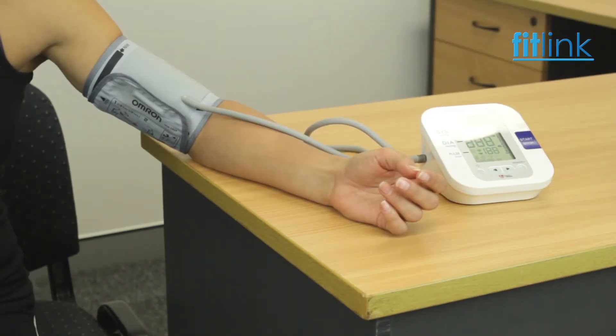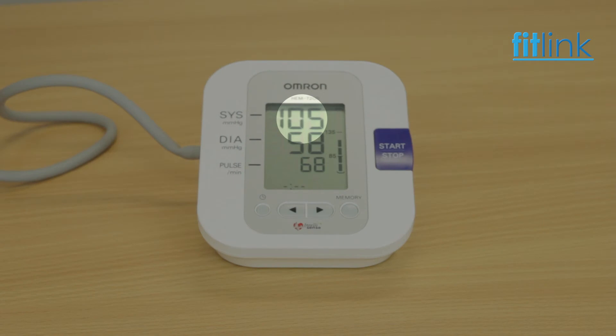Press the button or proceed to squeeze the rubber bulb to pressurize the cuff to around 160 mmHg. When pressurization is complete, the automatic exhaust mechanism will gradually reduce the pressure in the cuff and begin to measure both systolic and diastolic pressures and the resting heart rate.